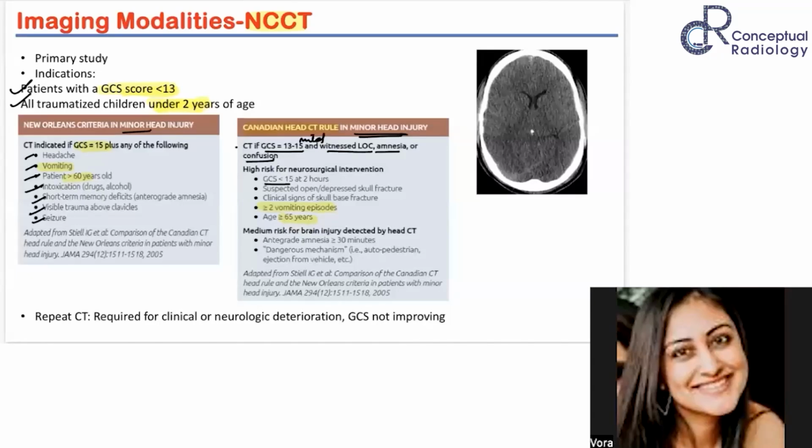And very important, again, something that we get from a clinical point of view: when is a repeat CT actually indicated? You must be getting a lot of requisitions, and the radiographer ends up doing them every time it is requested, but you need to know what the actual indication is.